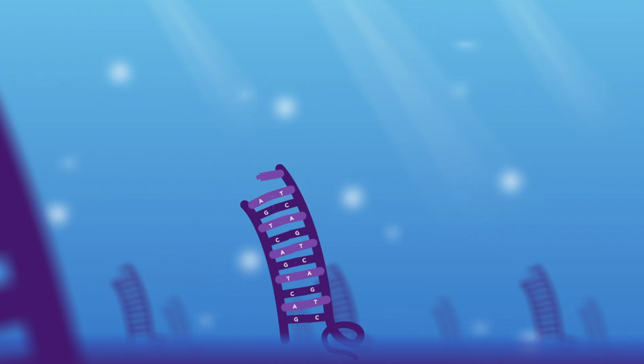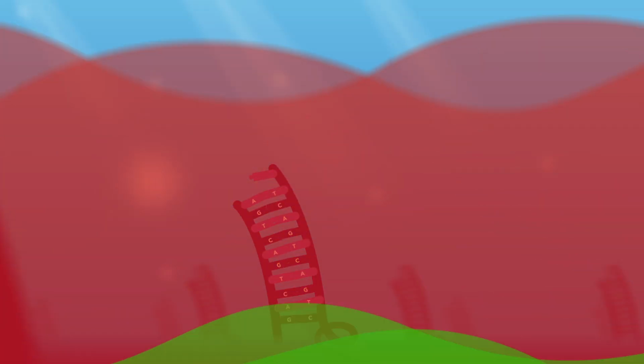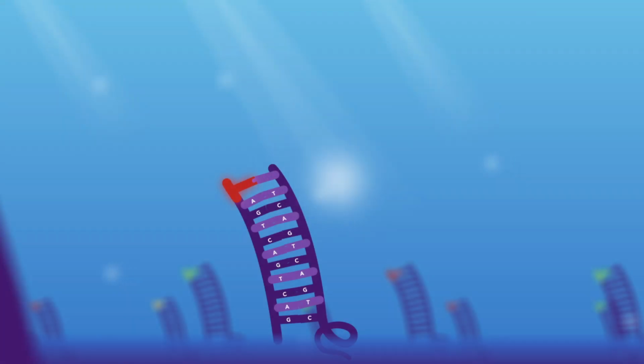Once a piece of your DNA hooks up with its Velcro probe soulmate, we want to look at the letter in your DNA that comes just after the end of the matching probe. And to do this, we use colorful fluorescent dyes. Ooh, color! We wash your chip with a mixture of fluorescent red and green dyes that are attached to loose DNA letters. So A's and T's are labeled with red, and the C's and G's are green. And whatever color letter combo sticks to the end of the probe tells us which variant you have at that location.